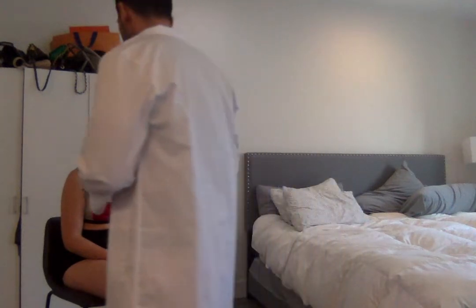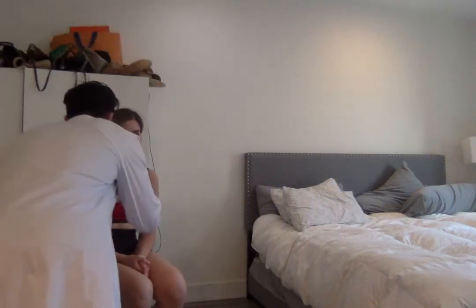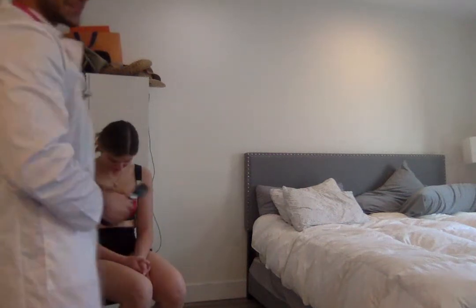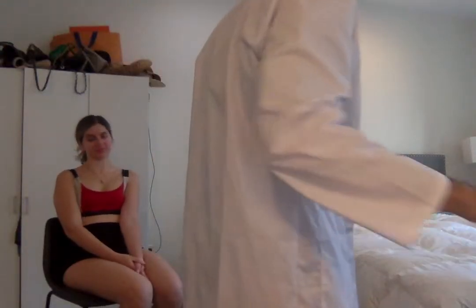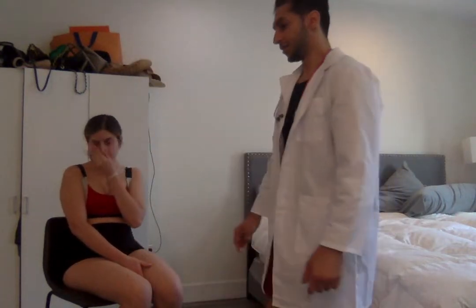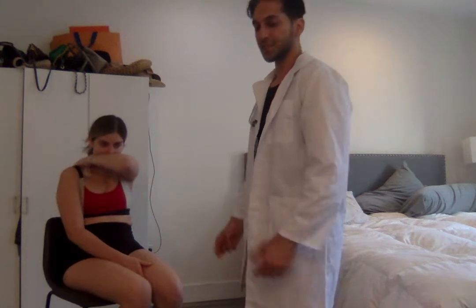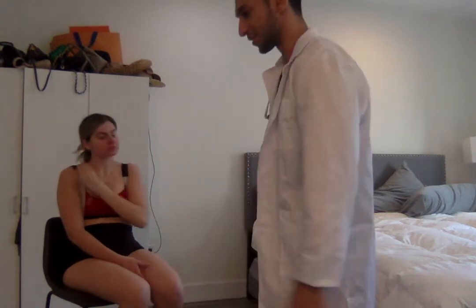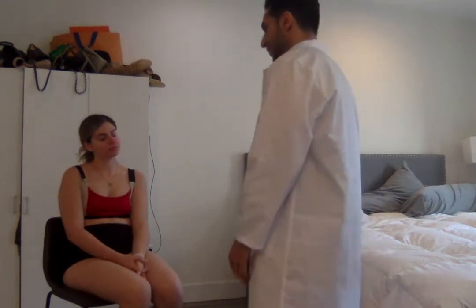Let me see this on this side. Okay, so red eye reflex is there. Same thing, I didn't find any opacity. The retinal vessels are intact. The disc margins are sharp. Didn't see anything abnormal in there. Basically, it's the same thing as the right eye.